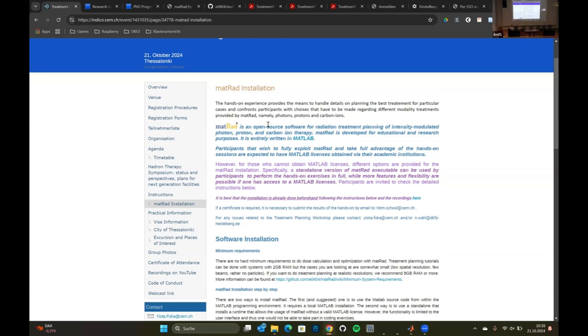So we decided for MATLAB, though today, if we would do it again, we would probably take Python or something like this as a more accessible language, because MATLAB is a proprietary programming environment and programming language. A lot of universities have it, so often when we give these courses, a lot of people can install MATLAB because they get a MATLAB license from the university.